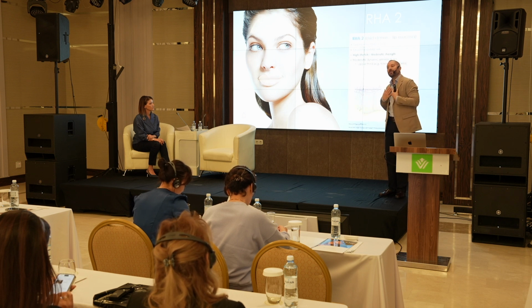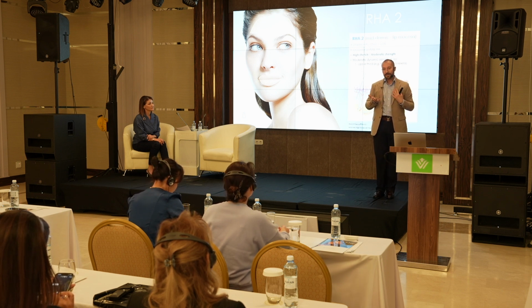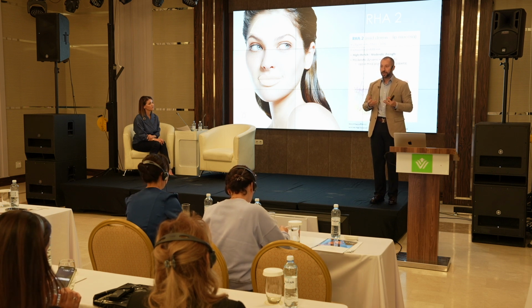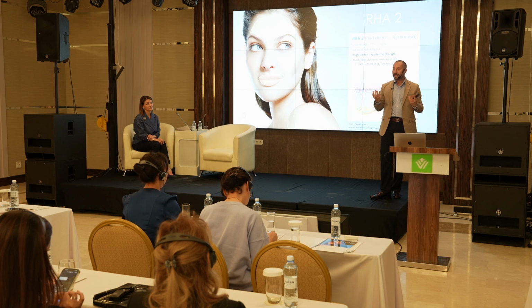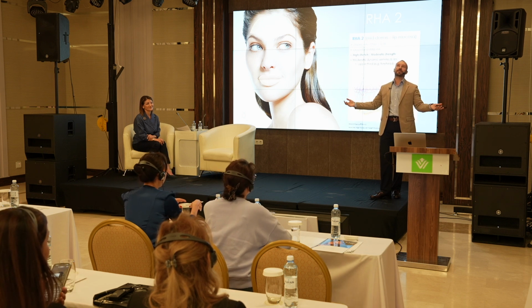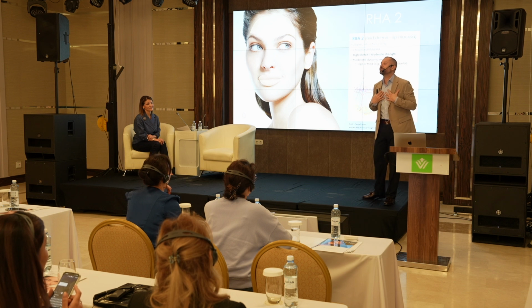RHA 2 is one of my favorite products. I love it for the lips. I will talk about the lips and perioral area in the afternoon, after lunch, but you can also use RHA 3 for the lips. Of course, patient expectations and needs are important in choosing the right product. For example, Turkish and German patients are different. In Turkey we have thicker lips, they need more. But the Germans are a little more conservative, they need less. When I say a 1 cc syringe, they are shocked. They need less. That's why I understand why RHA Kiss is really important.